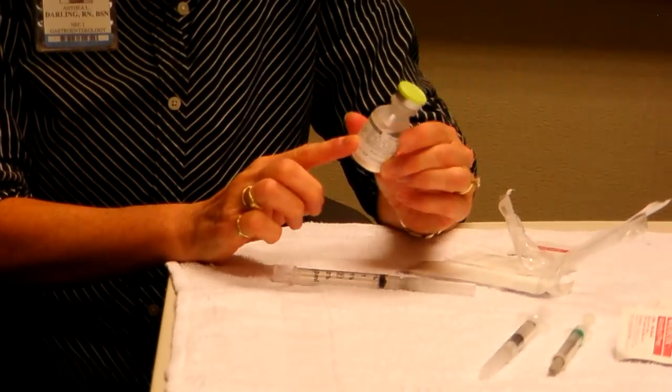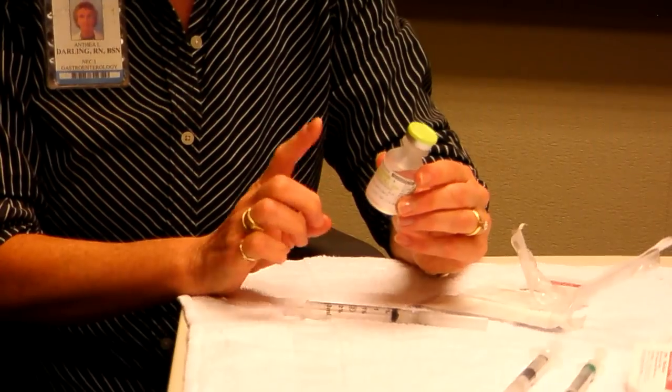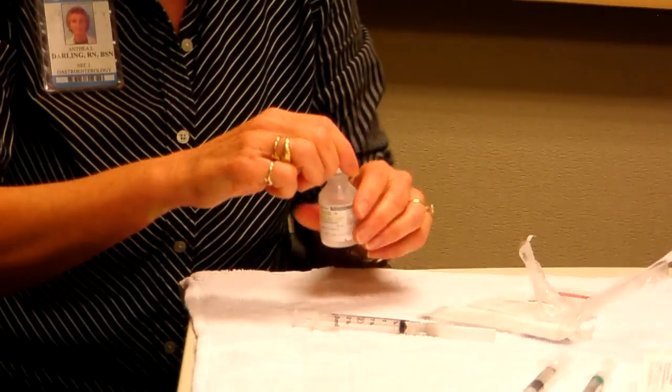Get your medication. You want to double check and make sure that you have the right medication, the right concentration of the medication, and that you know exactly how much of the medication you are supposed to administer.